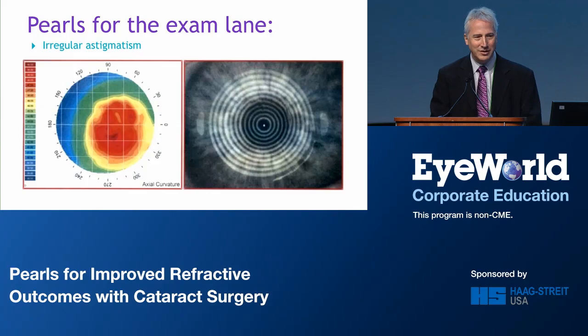Then we look at this and we say, well, that is not quite normal. I'm sure all of you look at this and you say, there's some irregularity there. This is a hyperopic ablation that was off-center and an unusually oblate cornea, prolate cornea. And so we expect that we might have issues. And if this patient didn't have refractive surgery, we ask them which one they actually had because they did.